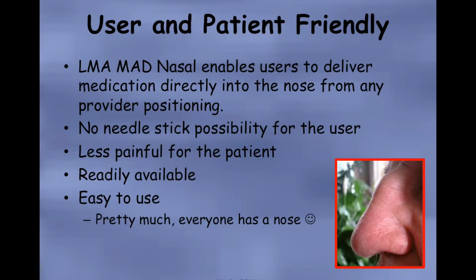MAD device does not require a needle stick, which is good for you. It's less painful for the patient, and you don't have the possibility of getting a dirty needle stick by using an IV. Pretty much everyone has a nose, and as long as the nose is in good shape, you should be able to use it to deliver the medication. And you will find times when you prefer to use MAD over an IV stick. Perhaps you want to deliver the medication more quickly. Narcan is much more forgiving intranasally. You're not going to be waking people up quickly, vomiting and fighting you, usually intranasally. But you will be able to use your own judgment on which is best for each patient.